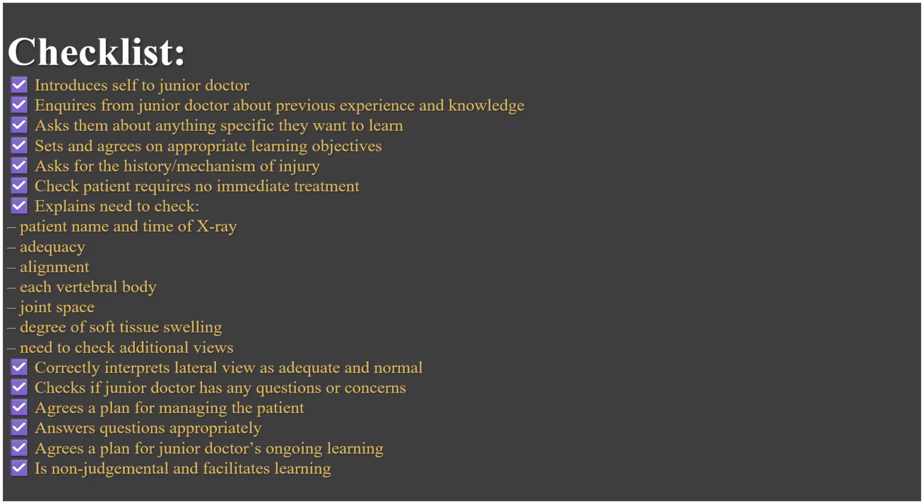But chest X-ray could be traumatic or non-traumatic. So you can check the history or the mechanism of injury if there is injury. If the patient has, for example, pneumonia, you will ask about history, not mechanism of injury, because no injury, right? Check the patient requires no immediate treatment, so you will ask, is the patient safe now? Can a doctor care about the patient? Like that. Easy?